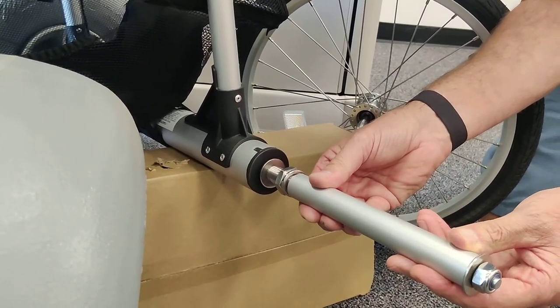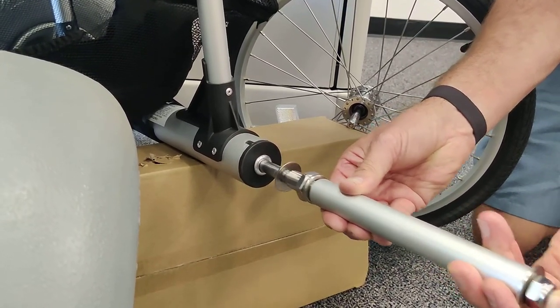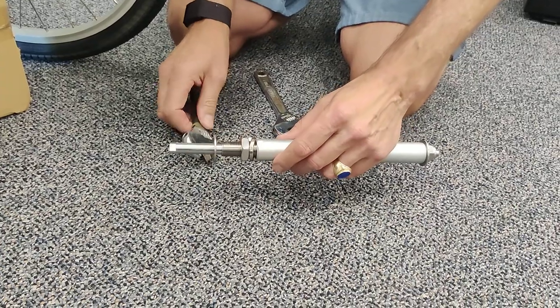Once we know that that's secure, then we can remove it and adjust the lock washer and nut to hold that position.